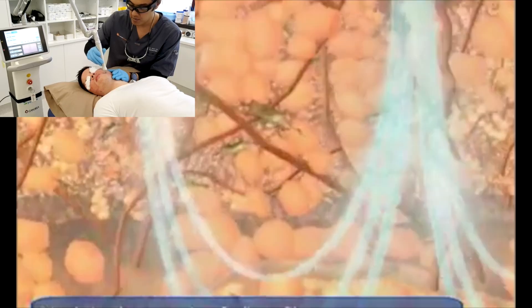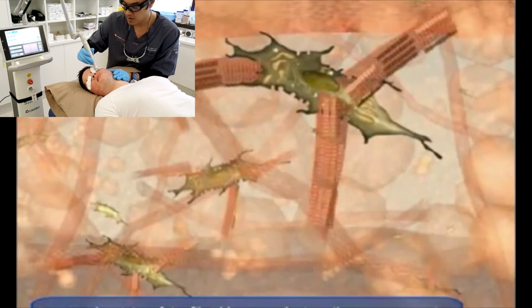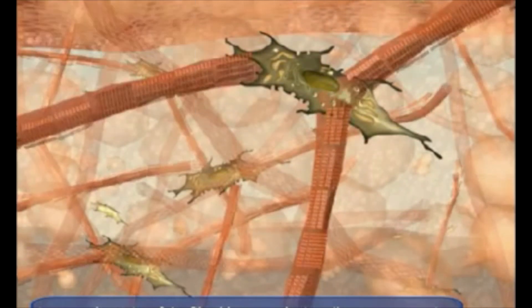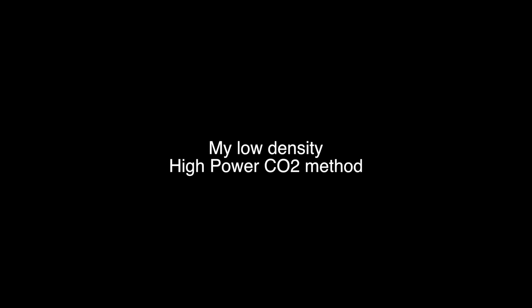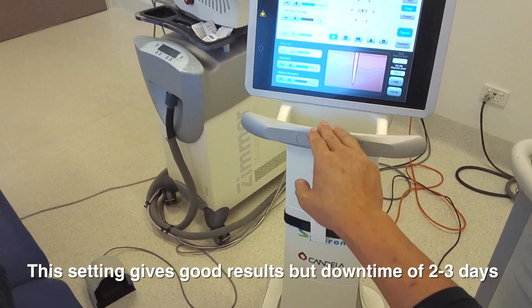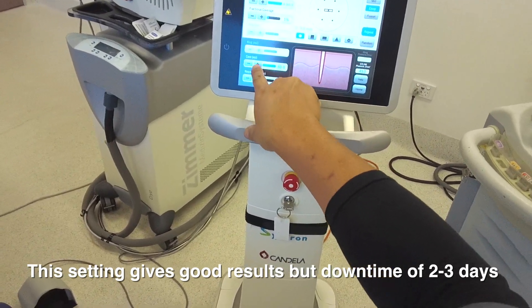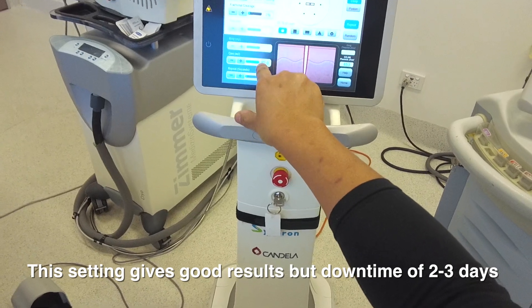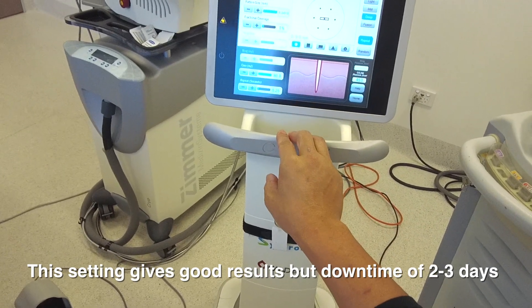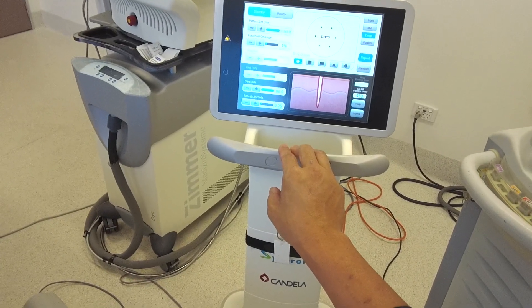As the name suggests, if we use a low-density, we can actually stimulate collagen production and hence scar remodeling for acne scars with minimal downtime. Using the low-density method means patients have recovered two to three days after the procedure. For treating acne scarring — severe acne scarring — I am using the CO2 laser in high power, which is 80 millijoules, the highest power setting, but the lowest density setting. We're using this on a patient who has severe acne scarring.